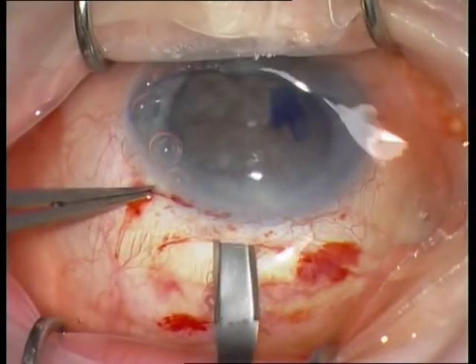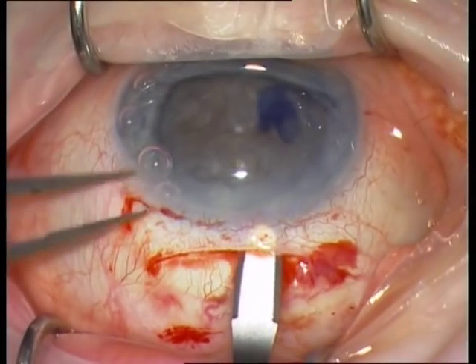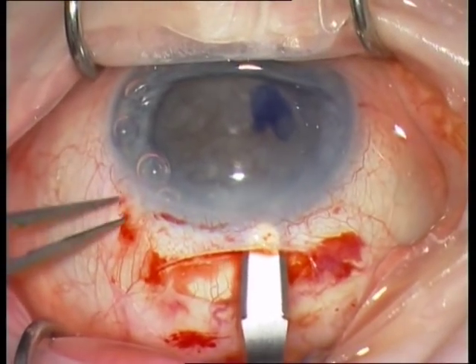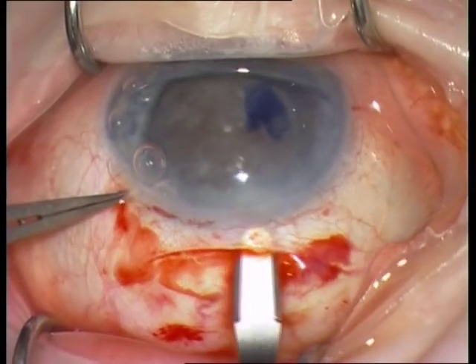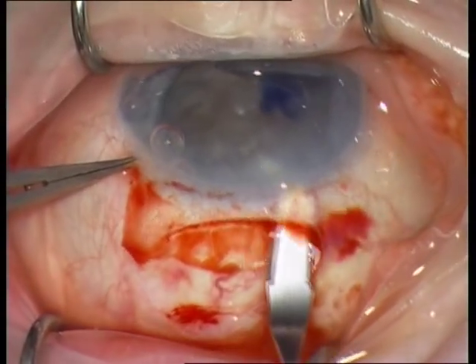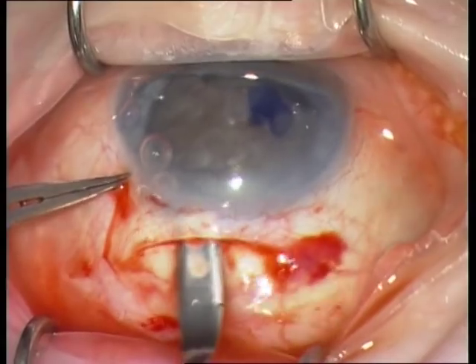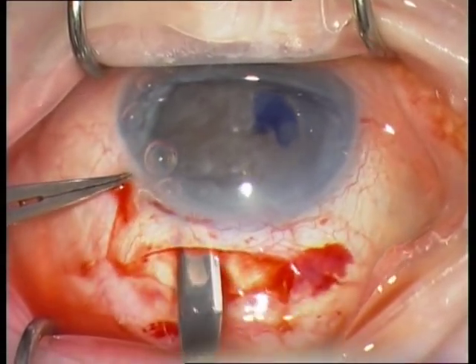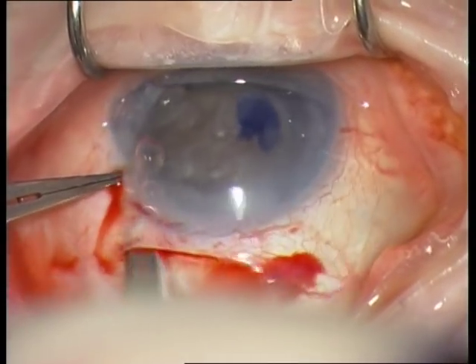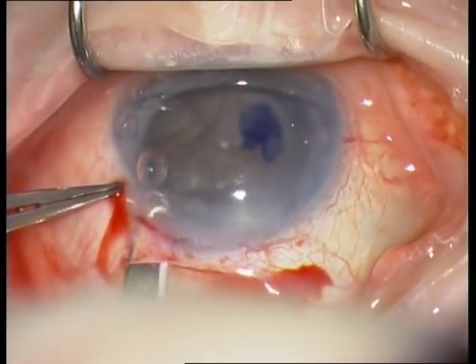For details of the knives, see the book. You should not be too deep and not too high with the knife. If you see the knife through the scleral tissue, you are just at the right height. Now you see the knife through the scleral tissue, so you are at the correct height.